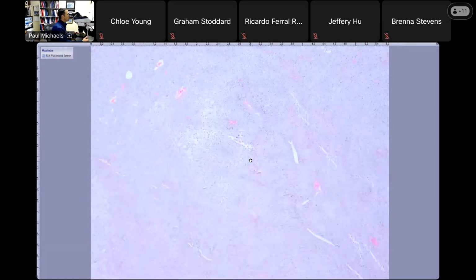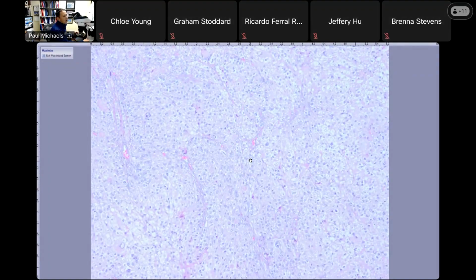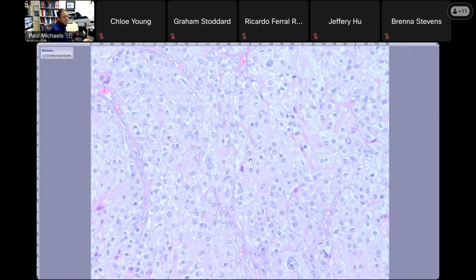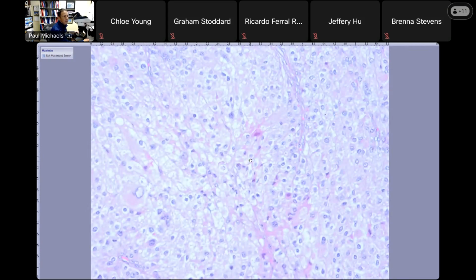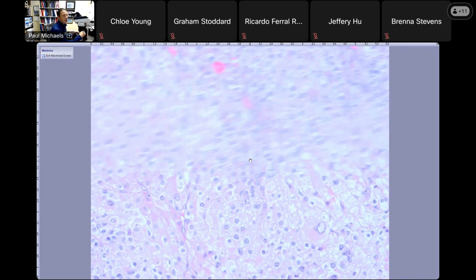Now here is the most common primary adrenal malignancy, and this is an adrenal cortical carcinoma. These can be hard, usually in one of two ways. Either they're hard because they look clearly malignant, often very eosinophilic. This is in the differential for a MET, like to the liver, the very eosinophilic looking tumor. You should think about an adrenal cortical carcinoma. So they're either hard because you don't think of it, or they're hard in the adrenal gland because you're not sure if it's an adenoma versus adrenal cortical carcinoma.